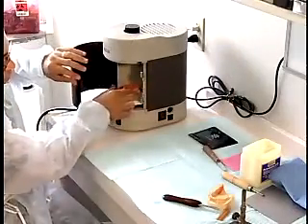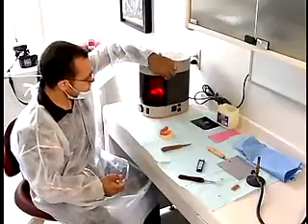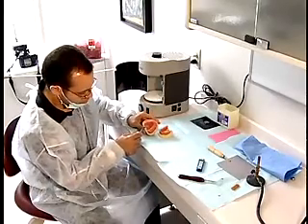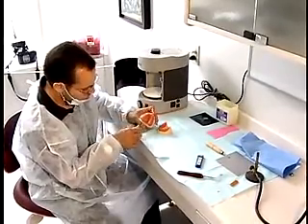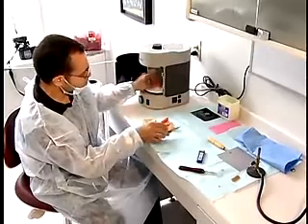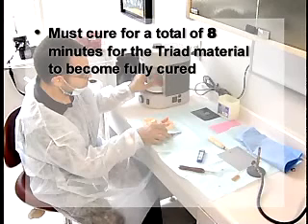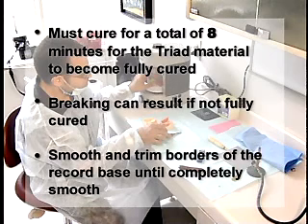Cure the record base for 4 minutes in the triad unit. Carefully remove from the cast. Invert and cure the tissue surface for 4 minutes. You must cure the record base a total of at least 8 minutes for the triad material to become fully cured. Breaking can result if not fully cured. Smooth and trim the borders of the record base until completely smooth.